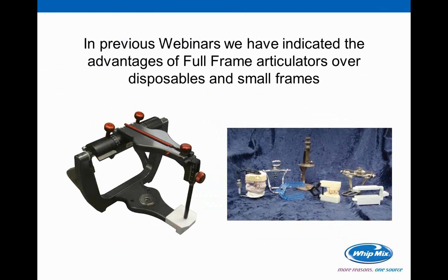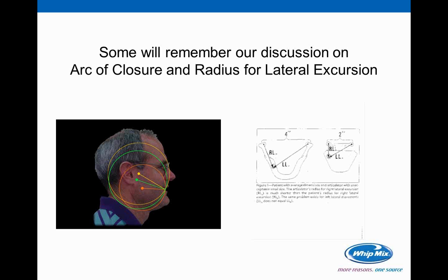In previous webinars, we've indicated there are advantages to using full frame articulators over disposable and small frame style articulators. We have some previous webinars on our website that you can go in and take a look at if you'd like, and improve your knowledge and understanding of full frame articulators and their use.